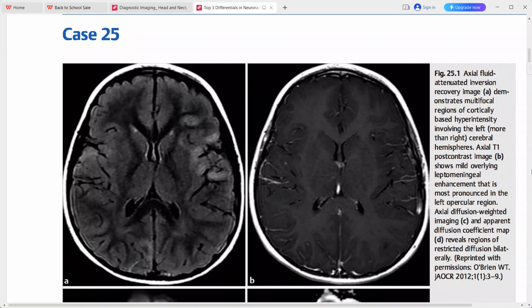This is a case of an adolescent presented with new onset headache and seizures. This is the FLAIR sequence axial and this is the post-contrast sequence. There are cortically based hyperintense areas involving the left hemisphere as well as the right hemisphere.